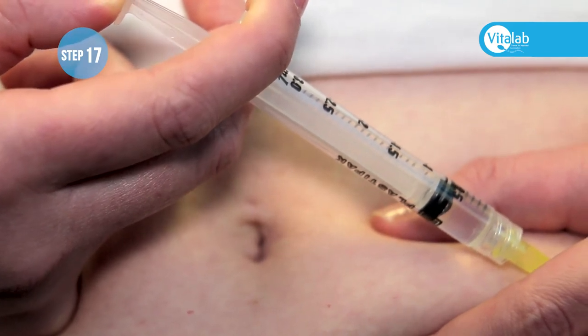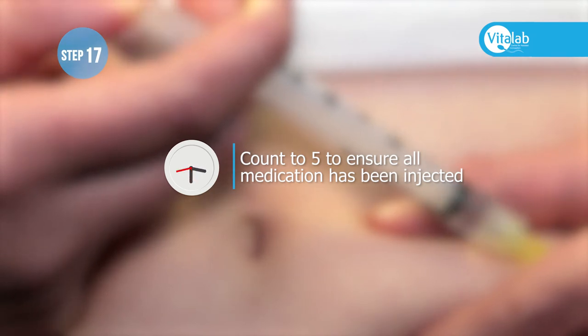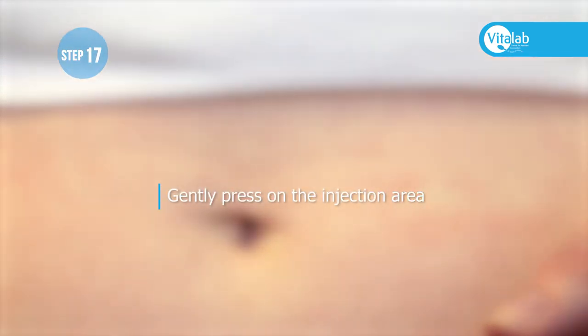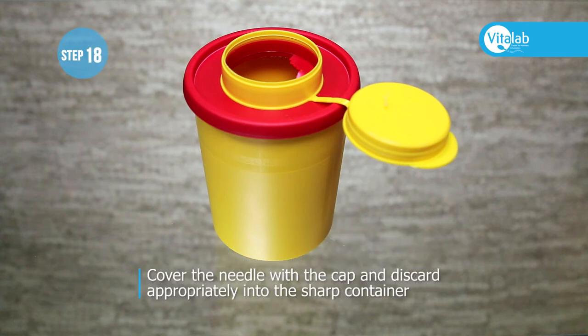Do not pull the needle out immediately — you can count to five to ensure all the medication has been injected, and then pull the needle out. Gently press on the injection area, cover the needle with the cap, and discard appropriately into the sharps container.